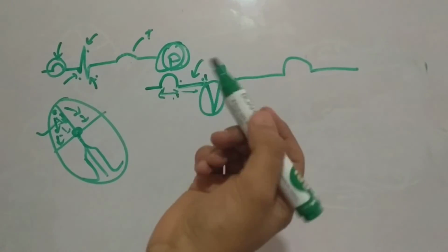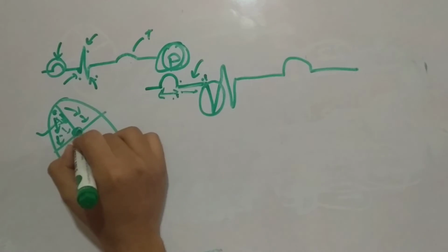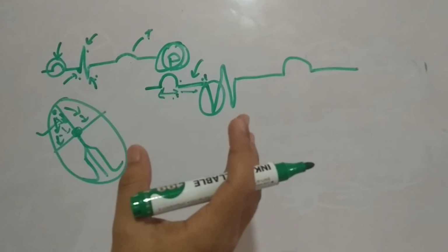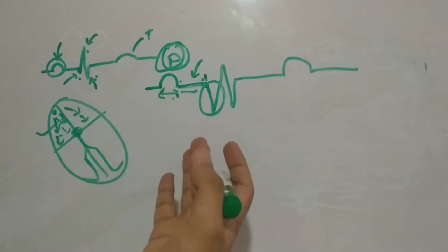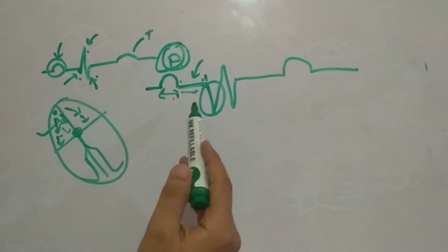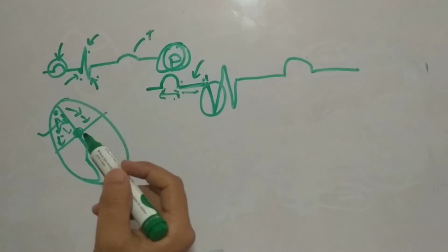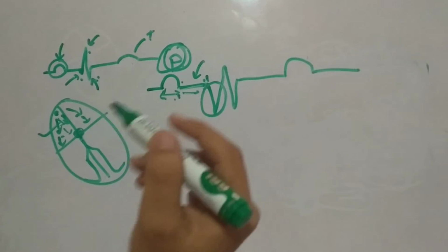Okay. So basically PR segment signifies that the electric signal has reached the AV node and there is some delay, and the electrical activity in the AV node is not being picked up by the ECG. So there is a flat isoelectric line. Is it clear? If you may ask why is there delay in the electrical conduction in AV node, I will draw a slight diagram.